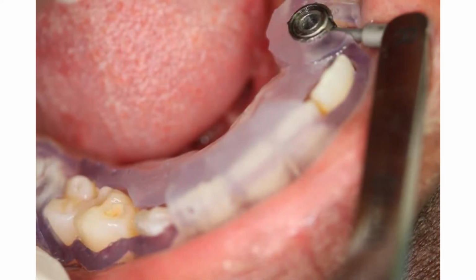And here we see the guide positioned in the mouth, and there's certain areas where the teeth are coming through, and we can see that this is down. It is fitting around the teeth here and here, and fitting around the lateral incisor, and also the spoon is fitting snugly and nicely inside the guide. So try all this in before you start. You don't want to be finding, when you've anaesthetized the patient, that you're having problems. So don't even anaesthetize the patient, try it all in.